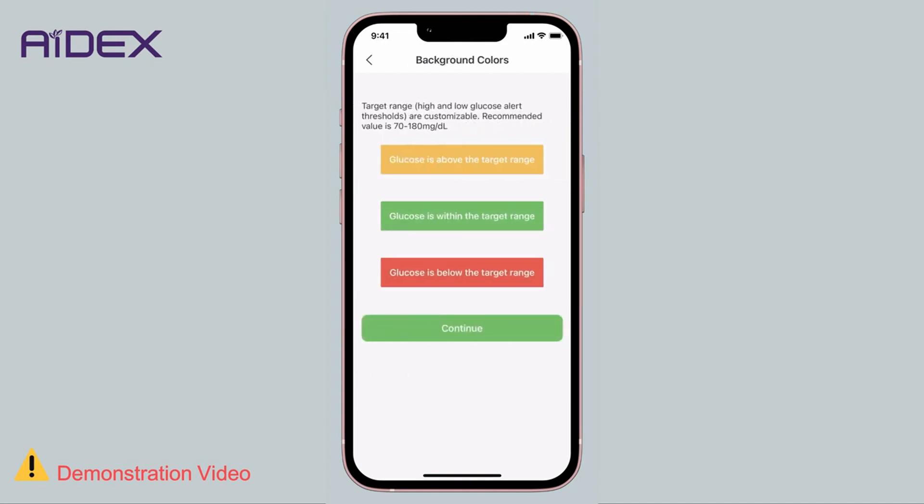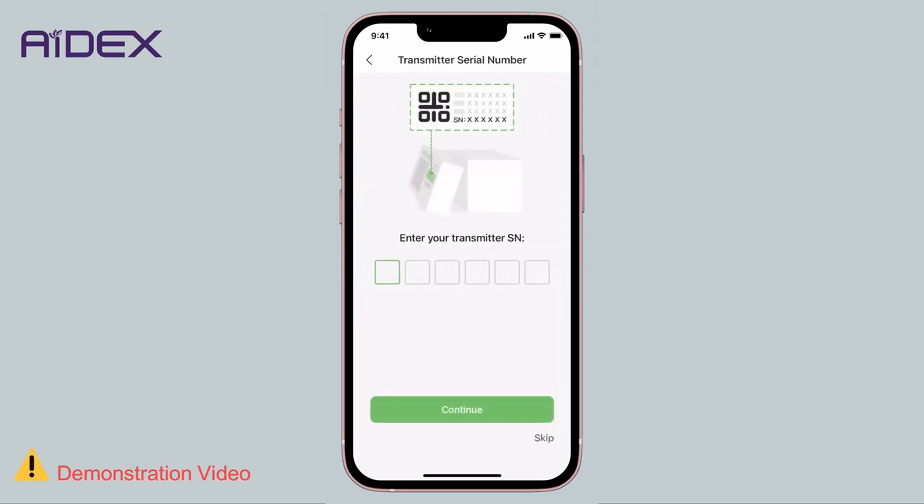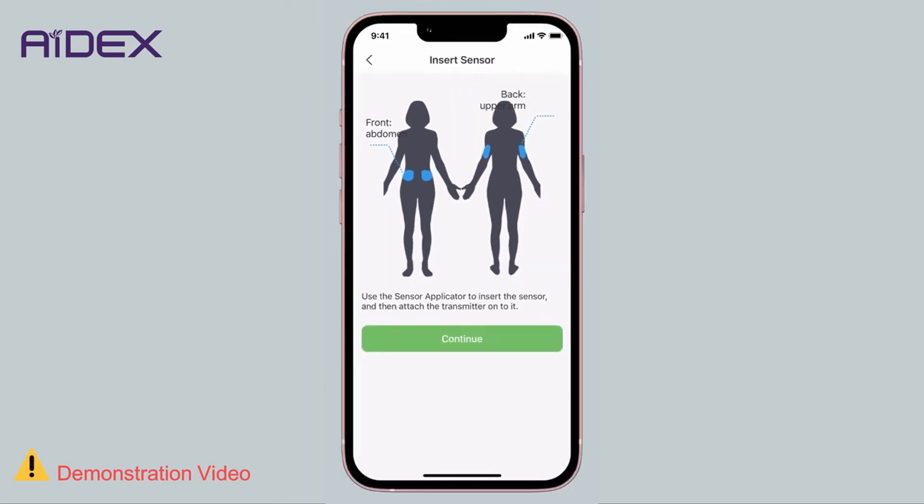The app's indication colors will be explained, and the app will allow you to set the upper and lower limits of blood sugar levels. You can adjust these settings from here or leave them as is for now. The last step is to pair the transmitter device. Before proceeding, make sure the sensor is already attached to your body, as pairing won't be successful unless the transmitter is already connected to the sensor. Click Skip for now. A screen will display the recommended sensor placement area, which is explained in more detail in a separate video. Tap Continue.